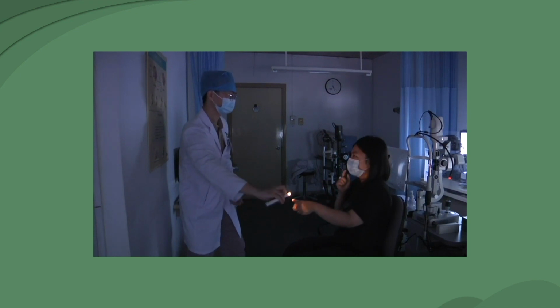The two eyes are examined separately. Routinely check the right eye first and then the left eye. Cover the non-inspected eye with an eye shield during the inspection. It is necessary to overcome accommodation in young individuals who are suspected to have accommodative excess, especially when there is esotropia. Sometimes accommodation relaxation can be achieved in adults by plus lenses. But otherwise, and always in children, accommodation has to be relaxed by cycloplegic drugs.